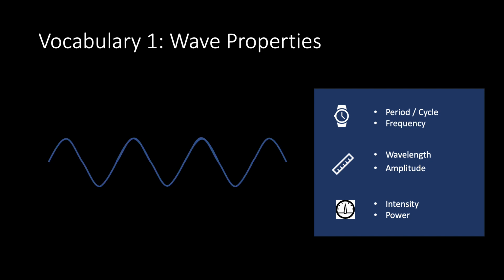But what if we wanted to make some measurements using distance instead of time? Well, we could definitely do that. So let's say we grab a ruler and we measure the distance between two subsequent peaks of waves. That would give us the wave's wavelength. And while wavelength is something we may be familiar with when we talk about visible light and the rainbow and spectrums of light as they interact on the electromagnetic spectrum, it's not necessarily as important when we talk about ultrasound waves. And that's because ultrasound waves are much more defined by their frequency than they are by their wavelength, which can often change.